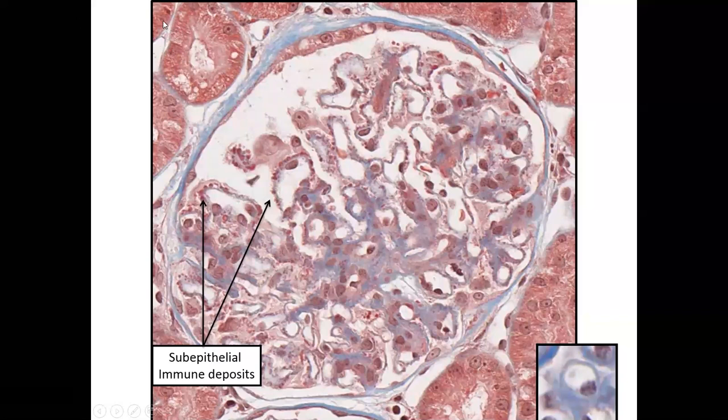So if a resident is trying to tell me that there's acute kidney injury and we're looking at the scope together, the first thing we look at is, are the tubules back to back? When I go over to the med school, that's the first thing we ask when we show the nephrologists the biopsy. We say, are the tubules back to back? And we make them answer that question. If they say no, then we have to say, okay, is it edema fluid in there or is it collagen? And so sometimes it can actually be a mix of a little bit of collagen and a lot of edema.